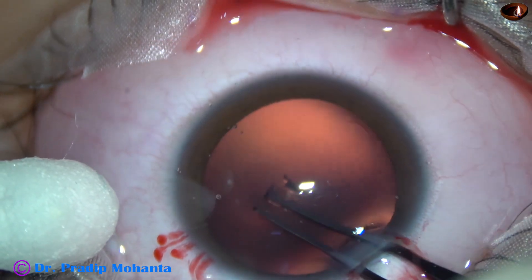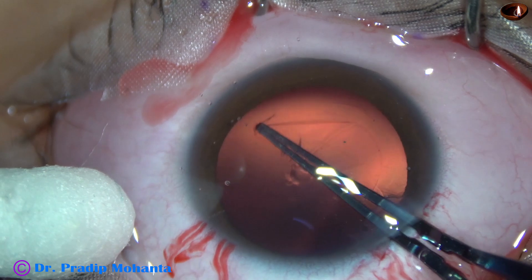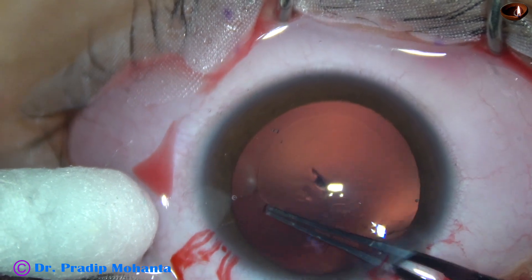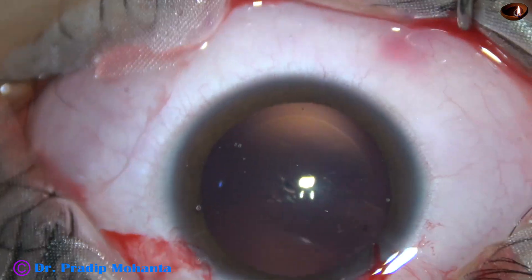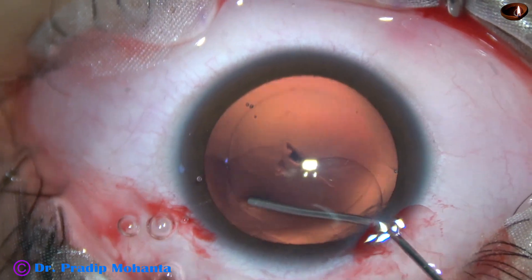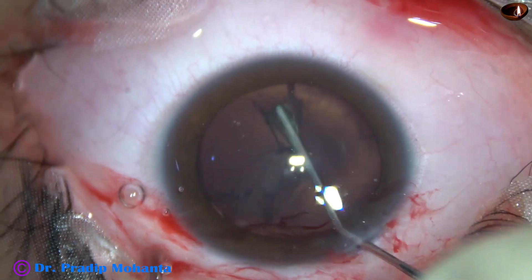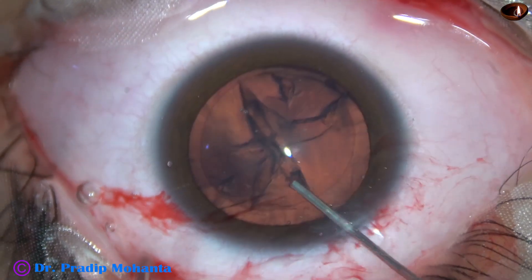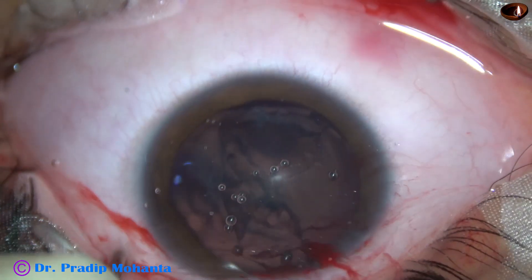The capsulorhexis is being done with the help of utrata forceps. My plan is to get a rhexis of about 5.5 millimeters in diameter. Because the patient is young, fibrosis of the anterior capsular rim is likely to occur and there is a risk of capsular phimosis, so I wanted to keep the size of the rhexis on the larger side — about 5.5 millimeters. Hydrodissection has been done with a very mild amount.